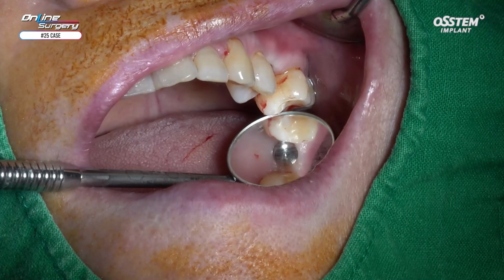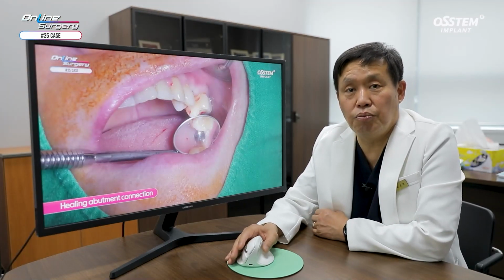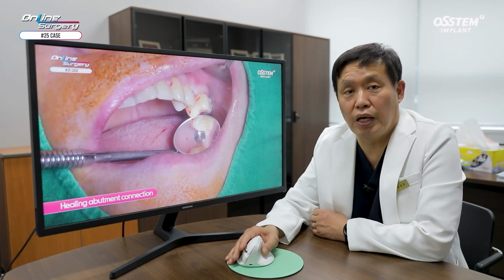Socket preservation using A Oss was done previously, and on the palatal side, if you look at the CT before surgery, there's a bit of resorption, but actually the implant has been placed deeply, so there were no major issues.